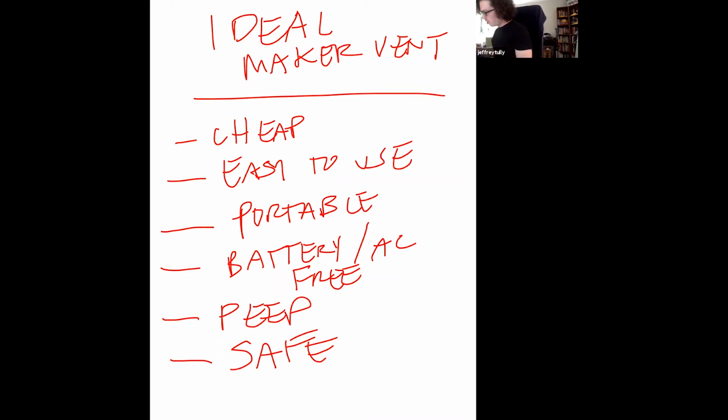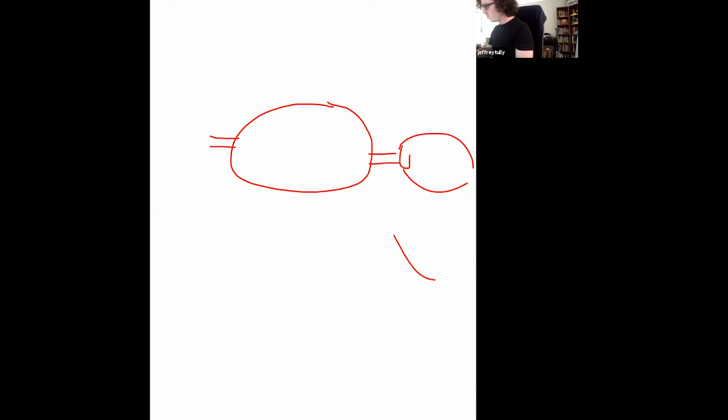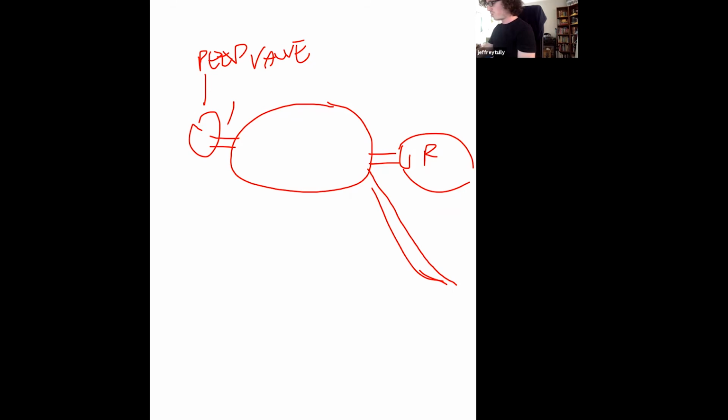And in fact, a lot of these requirements are met with what we call our Ambu Bag setup. You might have seen this in the ER or something like that, but you have these self-inflating bags. They have the ability to be hooked up to an oxygen source. There's a reservoir bag. They self-inflate because they have one-way valves, so oxygen flows in and it can't flow out until you squeeze. Some of them have the ability to have a PEEP valve at the end. There's an expiratory valve so that patients don't rebreathe. And then there's a connection to a ventilator circuit.